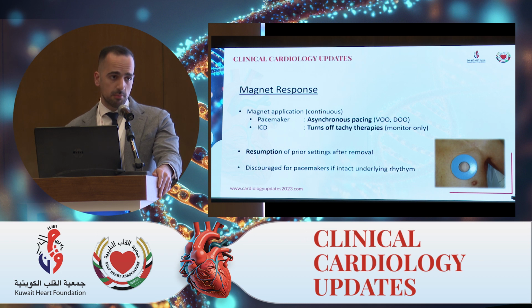In defibrillators, putting on a magnet will immediately turn off any tachycardia therapies. As long as the magnet is on the defibrillator and is sensed by the device, no shocks will be delivered. So in the previous situation where a patient's getting shocked by his ICD and continues to get shocked while being in sinus rhythm, putting on the magnet will inhibit these therapies and you can proceed with managing this patient while avoiding further shocks.